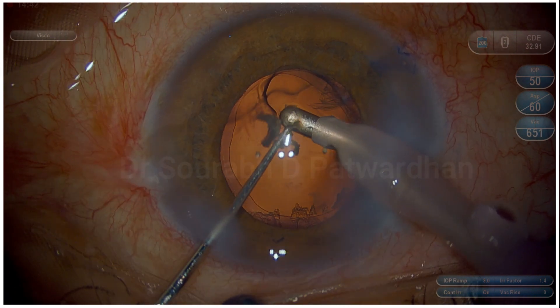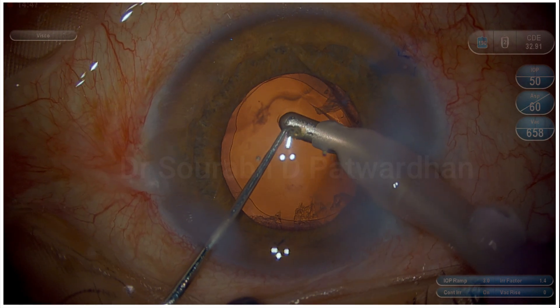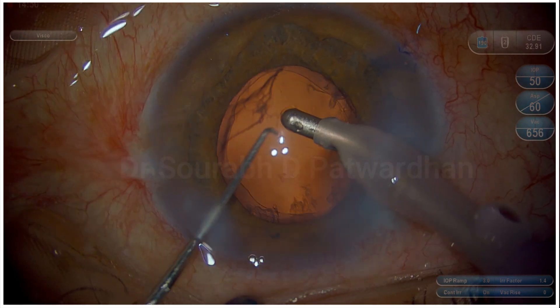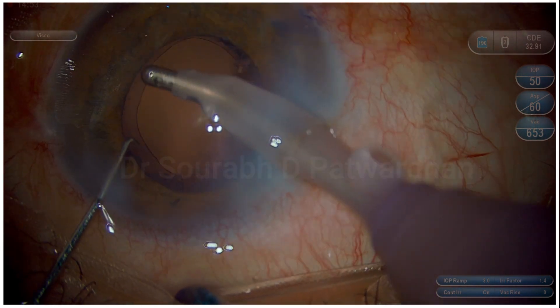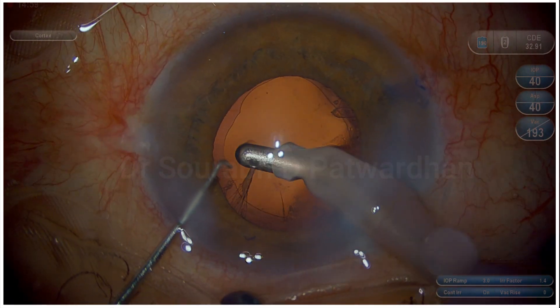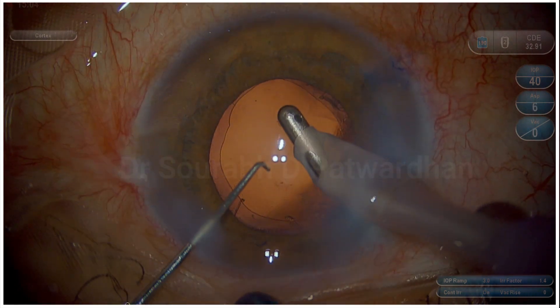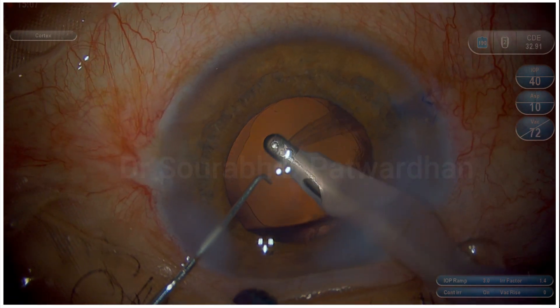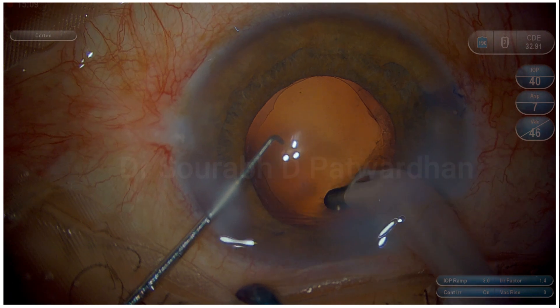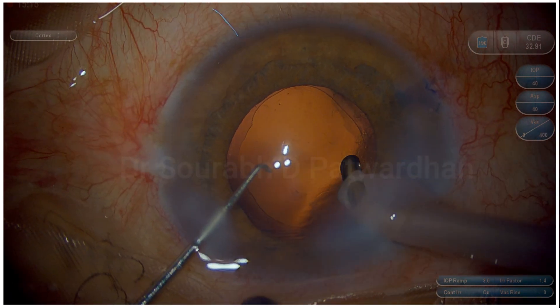The small remaining piece was taken out with the left hand sinskey feeding the phaco probe with that small nucleus. Always important to wash out the cortex — of course it was a mature cataract, but there will still be some thin cortex remaining. Always use a little low vacuum in the periphery to remove this loose cortex. Don't make exaggerated attempts to polish these kinds of capsules, which are already fragile.